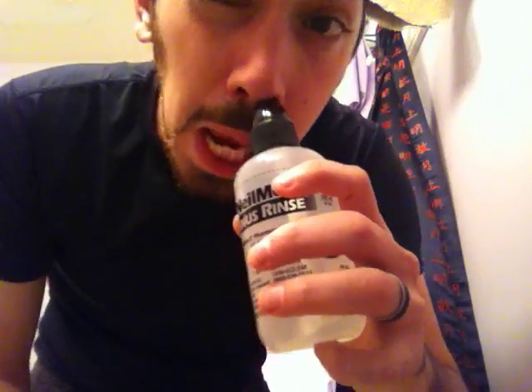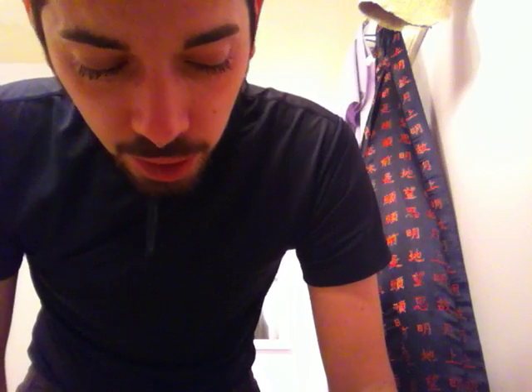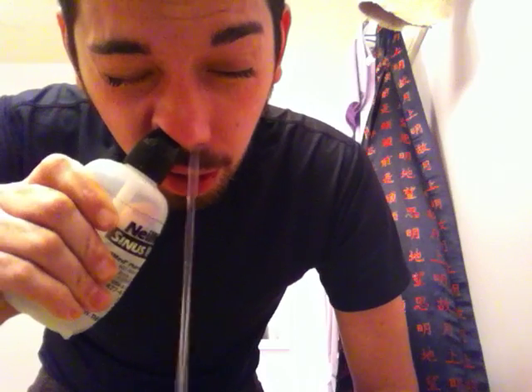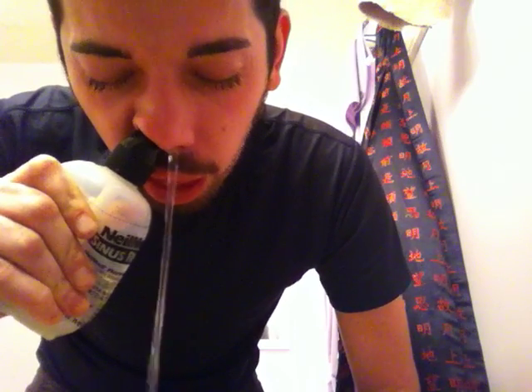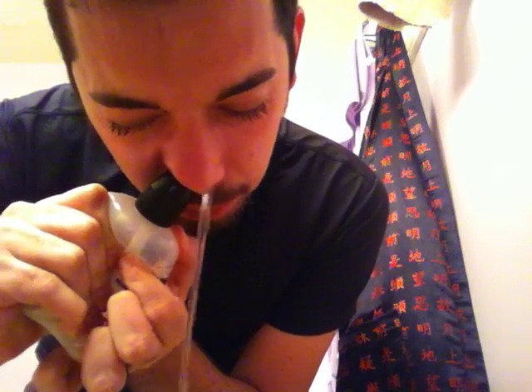Shake it up. And stick it in your nose. And squeeze. Oh god. And then you do the other side. Keep going. Power through it. Oh god.